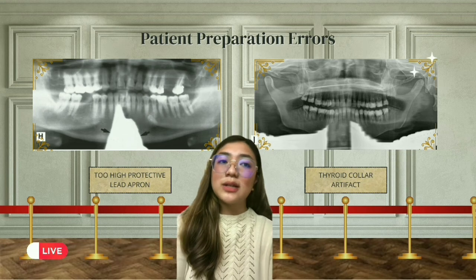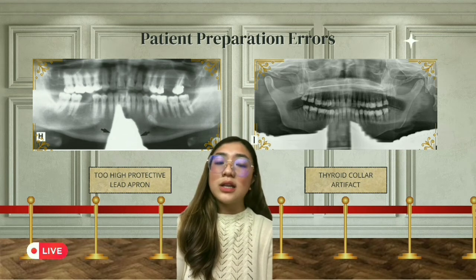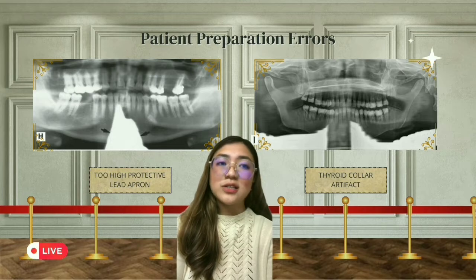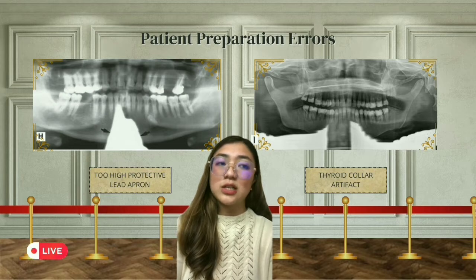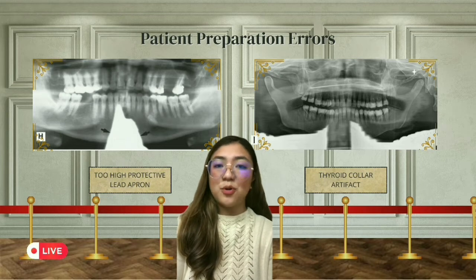If the lead apron is incorrectly placed on the patient, a radiopaque cone-shaped artifact results that obscures diagnostic information. Exhibit I shows a thyroid collar artifact. Thyroid collars are never used since they would attenuate the X-ray beam and produce a white, non-exposed area on the radiograph. If a lead apron with the thyroid collar is used during the exposure of a panoramic projection, a bilateral radiopaque artifact results that will obstruct the mandible.